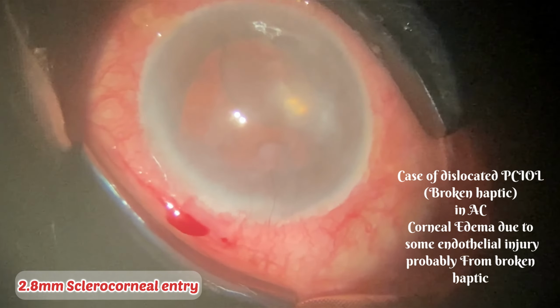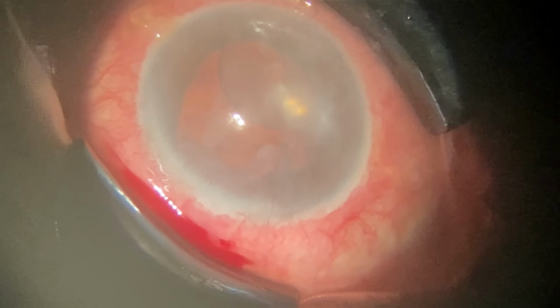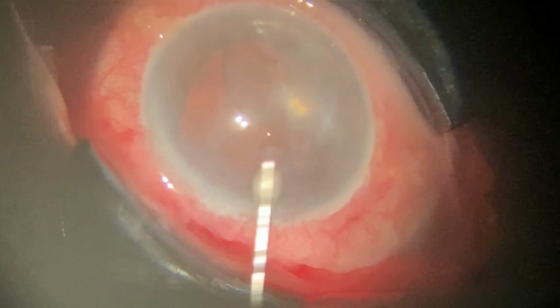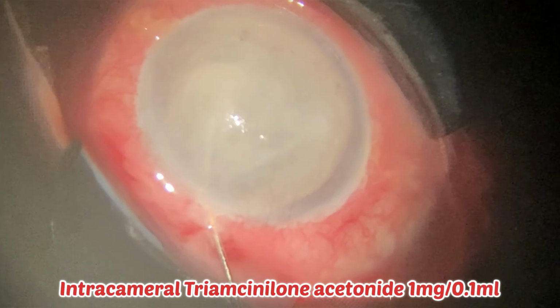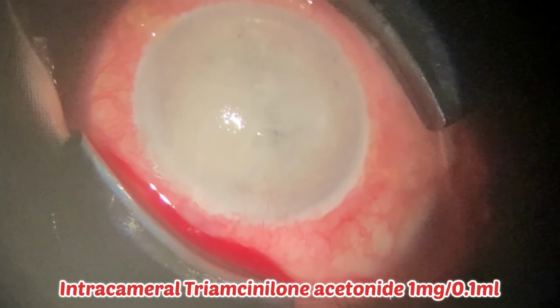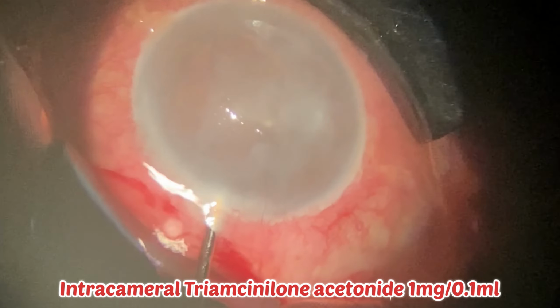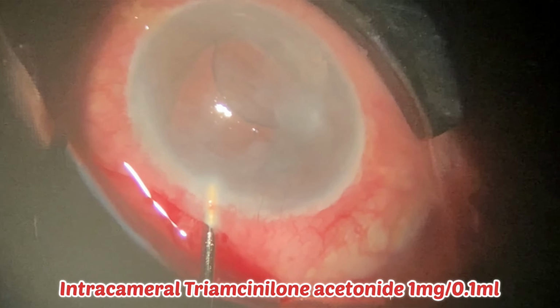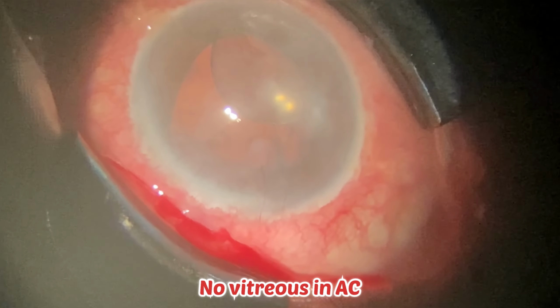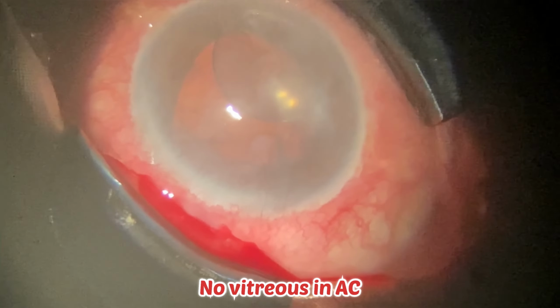So let's get started. This is a 2.8 sclerocorneal entry which I did with a 2.8 blade, and I am examining the intraocular lens. Subsequently, I inserted triamcinolone acetonide intracameral, 1 mg per 0.1 ml concentration, to check for the presence of vitreous, and now I am irrigating the anterior chamber to remove the triamcinolone acetonide. So there is no vitreous in the AC presently.